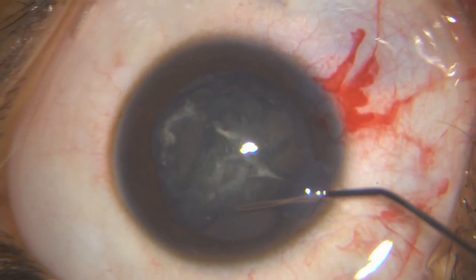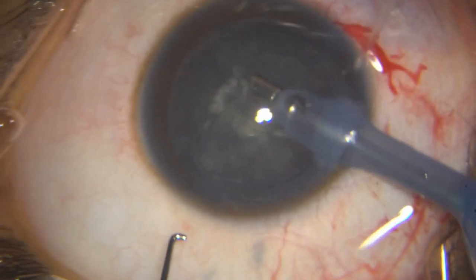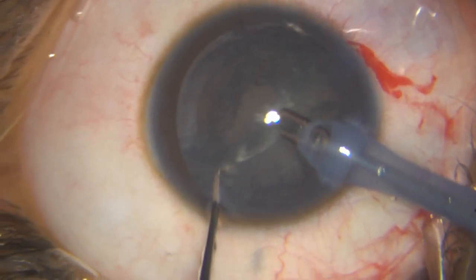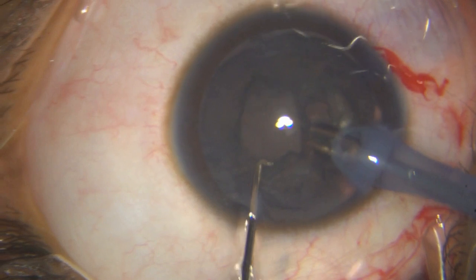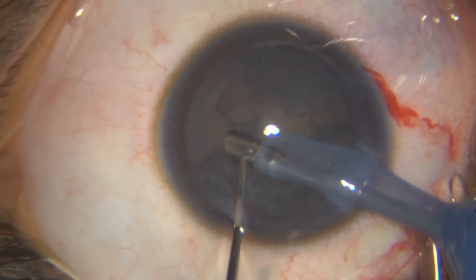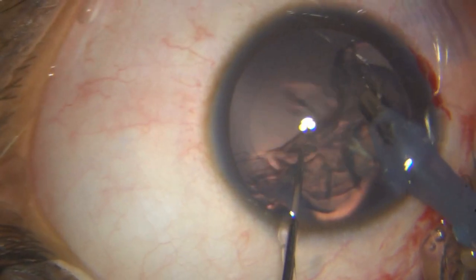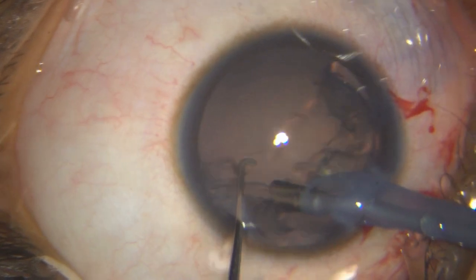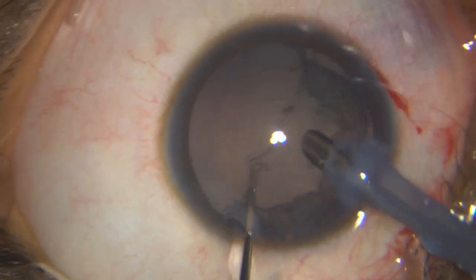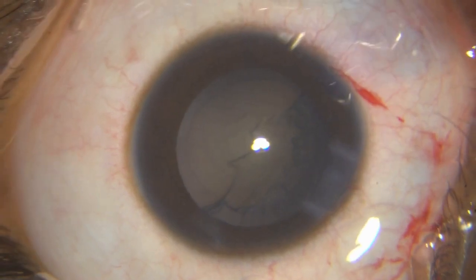Make sure you don't have a blowout of the posterior capsule, which is frankly speaking not possible. I go in with aspiration parameters and I am removing the nucleus, epinucleus, and some of the cortex, making sure I maintain all safety. For the superior part, I think it is safer to do it with the bimanual technique, and that's what I have done.